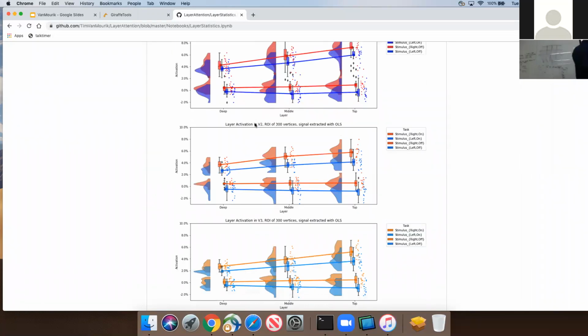So with this study, we try to make everything as openly available as possible, to give you a way of starting an analysis, but also to see end to end what problems arise when you're trying to do this. To think about problems of experimental design that you might not think of initially when you're starting your experiment.